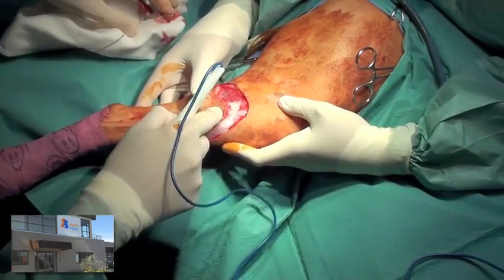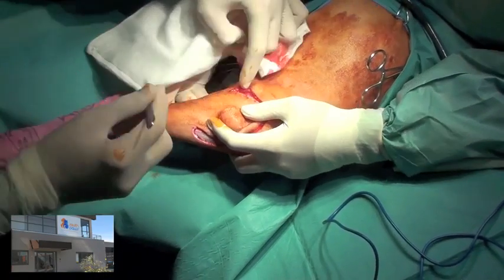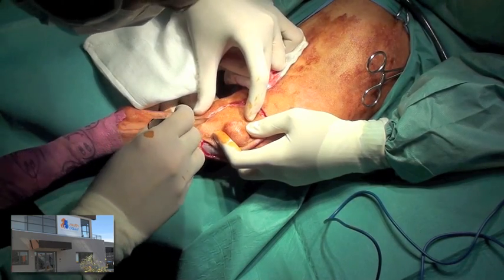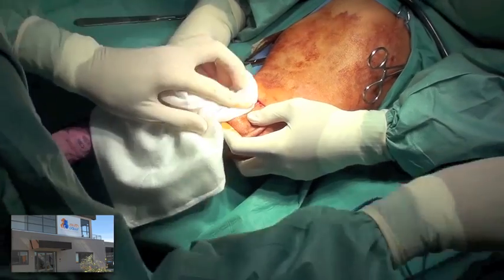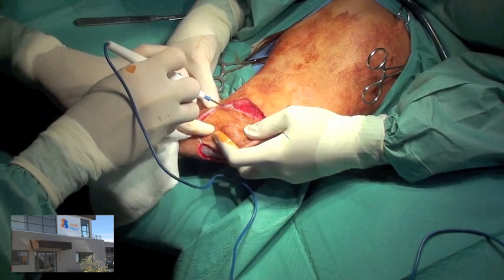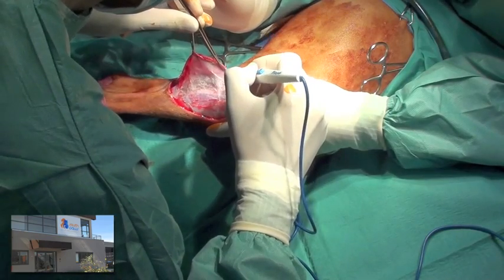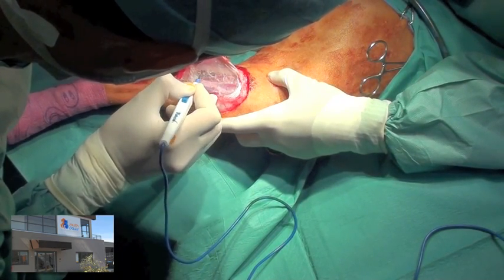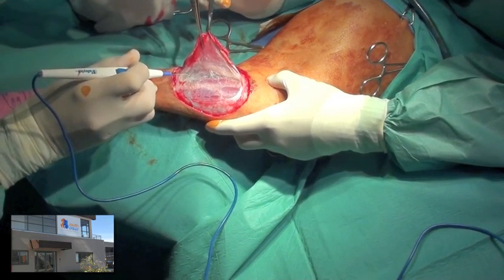Electrocautery is used to provide hemostasis and also for dissection of the deeper tissues. Once the fascia is raised, electrocautery is used to cut the connective tissue which lies between the fascia and the underlying muscle.